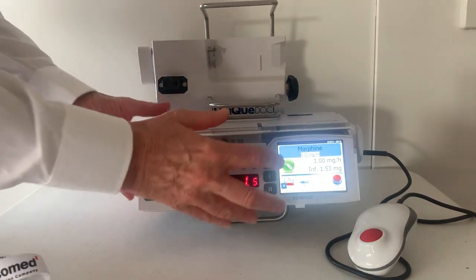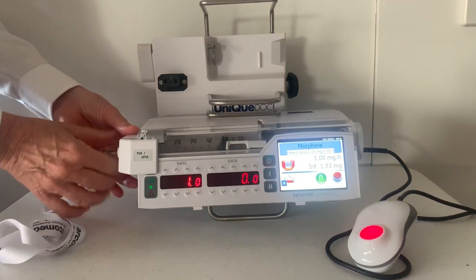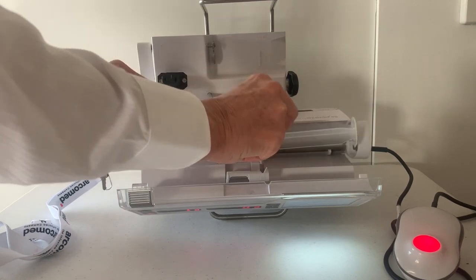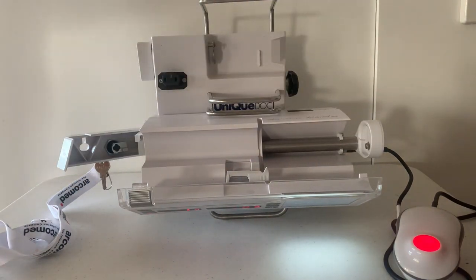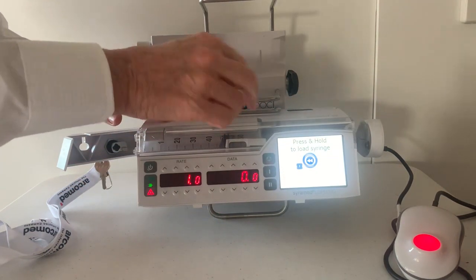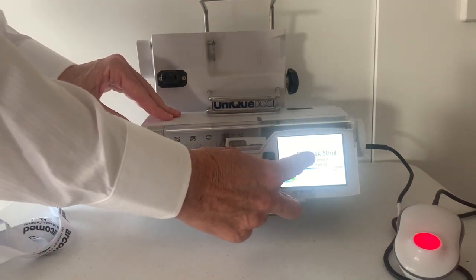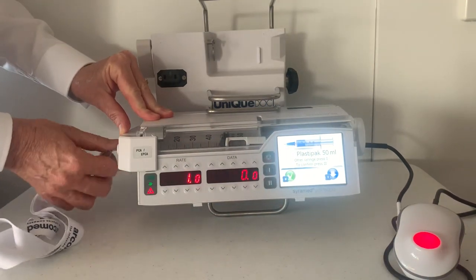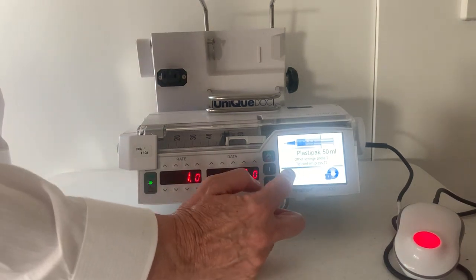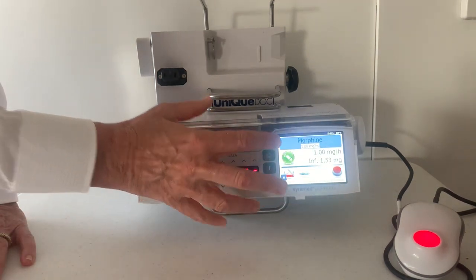I'm now going to demonstrate changing a syringe. Stop the pump, open the arm, use the grip to open the door and the clip. Place the new syringe over the clip and the door. Follow the prompts — press and hold to load the syringe until it is engaged. Close the door, lock the arm, and it's asking me to tick and confirm the type of syringe. If it is the same infusion as before, you can restart the pump.